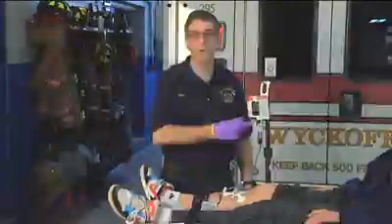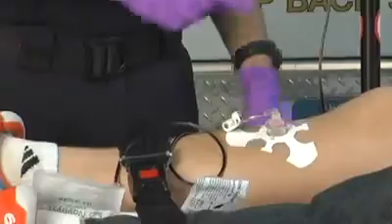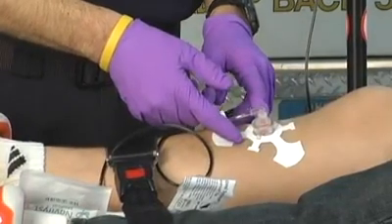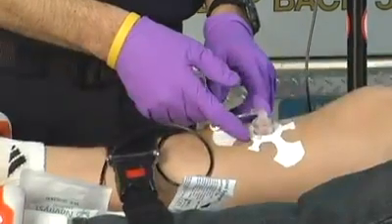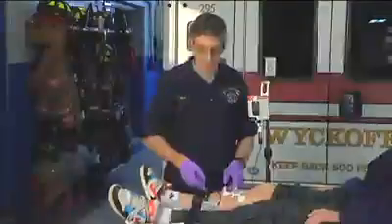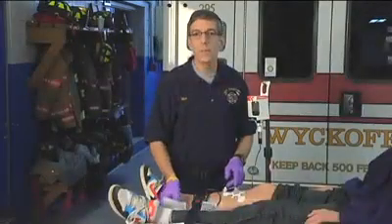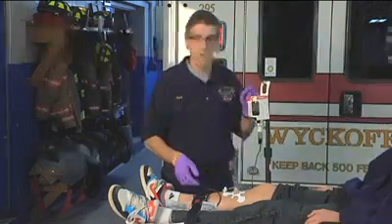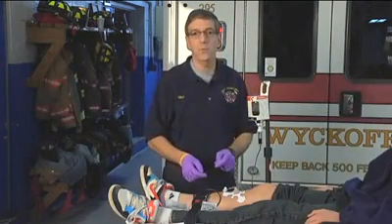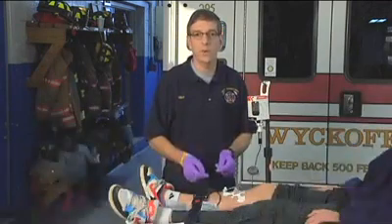We've run the medication through the tubing of the first bottle of the Cyanokit. We have an intraosseous line in the patient — many patients during resuscitation like this will end up with a 15-gauge intraosseous line, and that is the reason why we need a stopcock for this setup. In order to get this medication to run into the patient in seven and a half minutes, we're going to have to syringe some of the medication in ourselves manually.